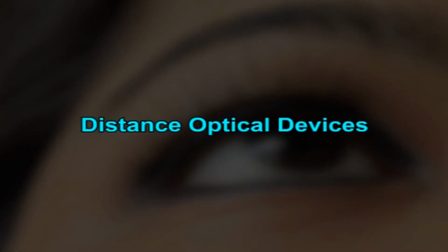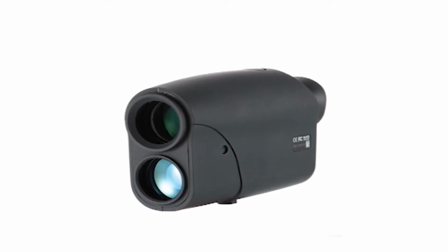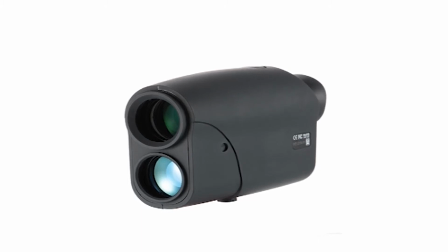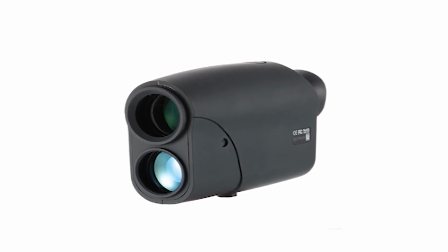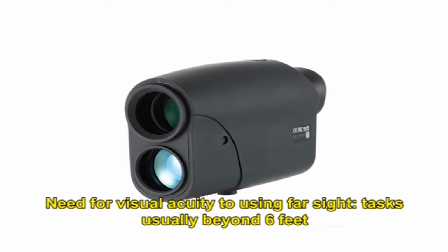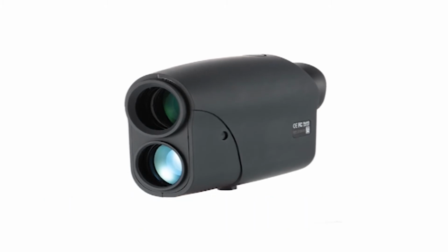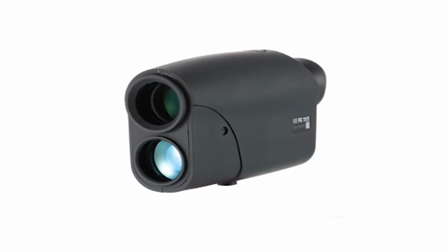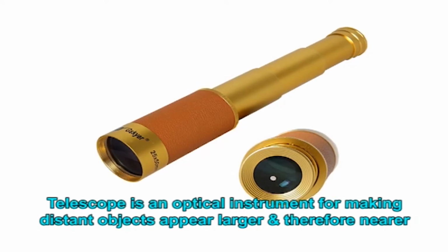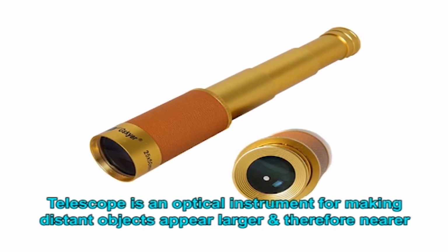Distance optical devices. Distance devices are best for activities such as television viewing, a visit to the movies or theatre, attending a sporting event and bird watching. Distant tasks include those activities with a need for visual acuity to using far sight. Tasks usually beyond 6 feet. These include common tasks that will aid a person with low vision in performing tasks which include handheld telescope. Telescope is an optical instrument for making distant objects appear larger and therefore nearer.